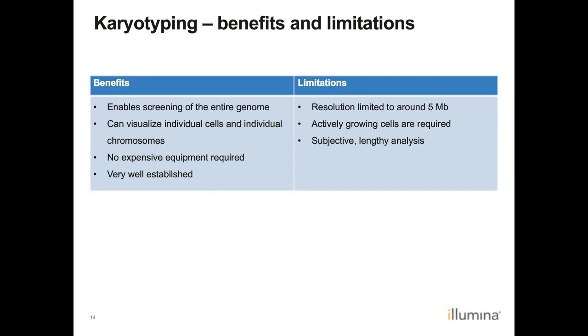Also, the analysis is laborious and time-consuming. It usually takes more than 3 hours per sample, and it is typically done by 2 independent analysts.